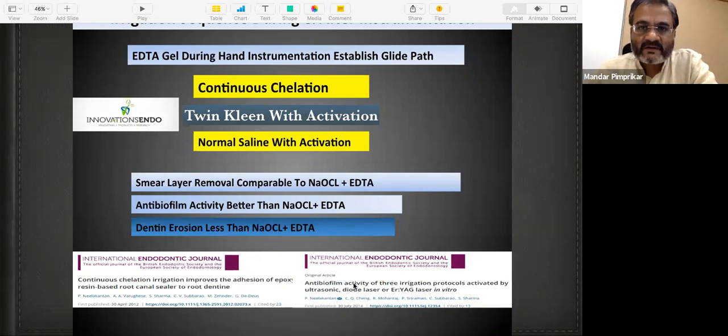Now, I was very fortunate to visit Hong Kong University to do a presentation there in 2018. And Prasanna did a lot of study on continuous chelation, and it's the preferred way of doing the irrigation now. It is also compatible with all types of sealers, whatever sealer you use in your practice, whether they are tricalcium silicates, or epoxy resin based, or MTA based. So continuous chelation is compatible with all the sealers which we can use.